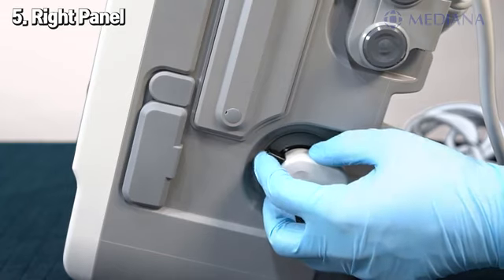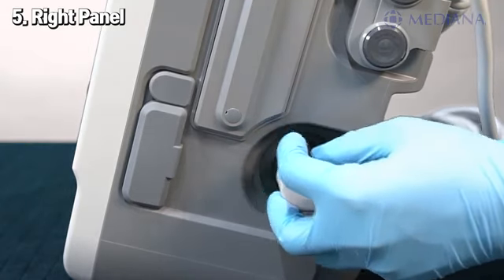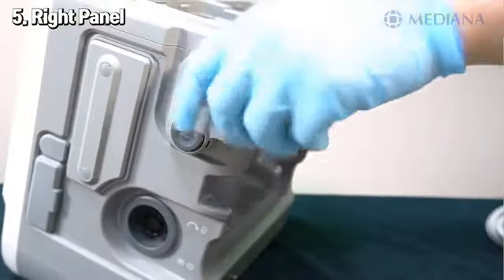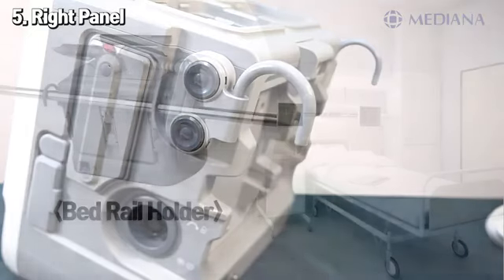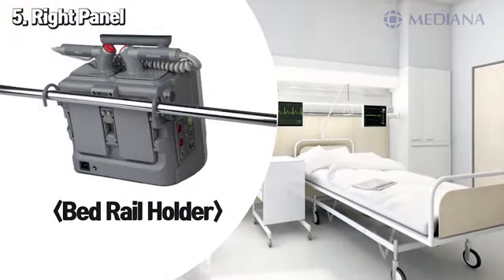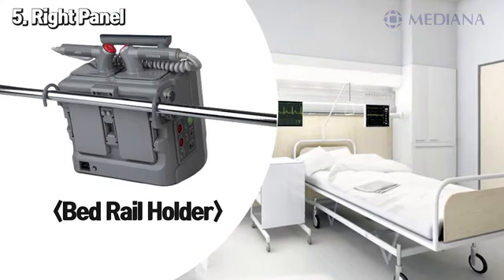When removing the connector, it can be removed by pressing the lever attached to the connector connection part. Also, this pads connector part is designed to be slightly inserted in the equipment, so it can be protected from external shock. Crucial for the patient's bed, the bed holder enables this device to be fixed on the patient's bed, enhancing convenience and usability for medical teams.